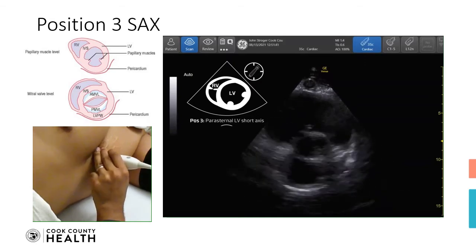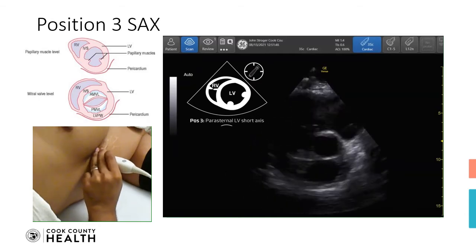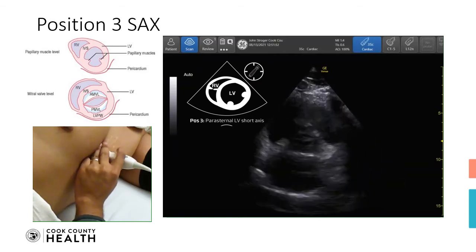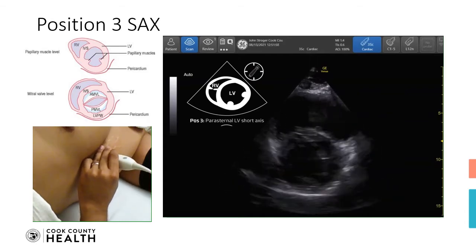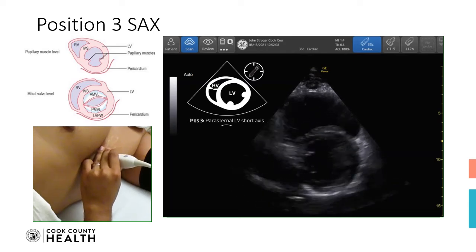You are scanning to the other side of the heart, and we are going to form new cross sections when you are scanning with the angle tilted differently. We'll go again to get the view of the parasternal short axis.